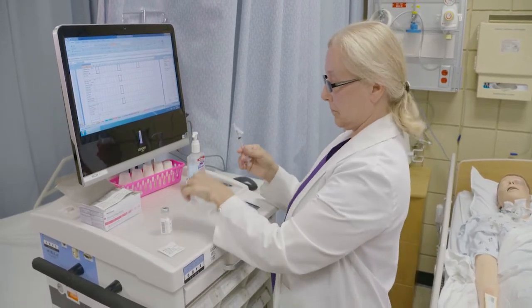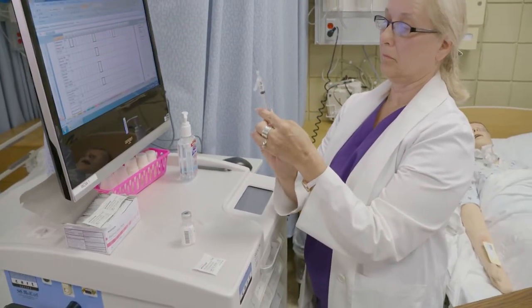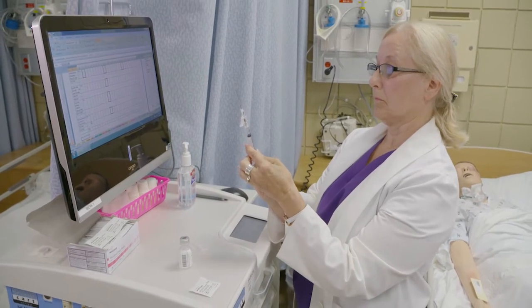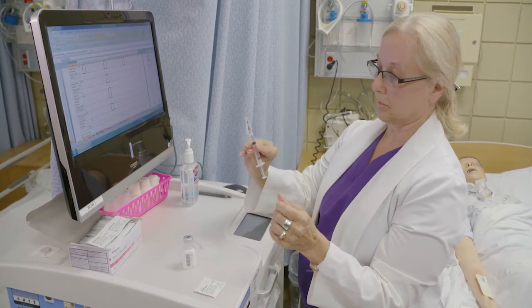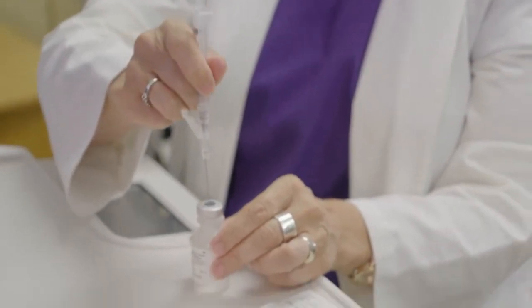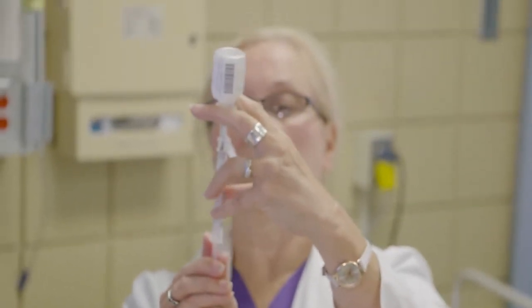Take the cap off the syringe. Be careful not to touch the needle end. The needle is sterile. Pull down on the plunger to 1 milliliter so air fills the syringe. Inject the air into the vial and pick up the vial. This allows equal pressure in the vial bottle to obtain equal medication into the syringe.